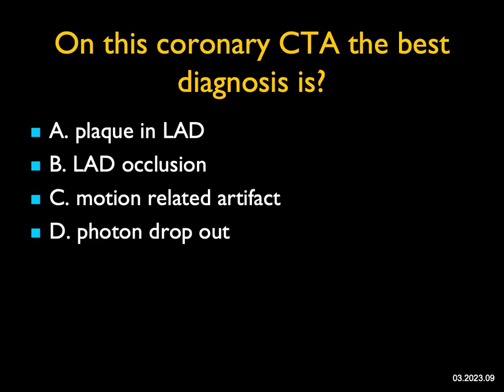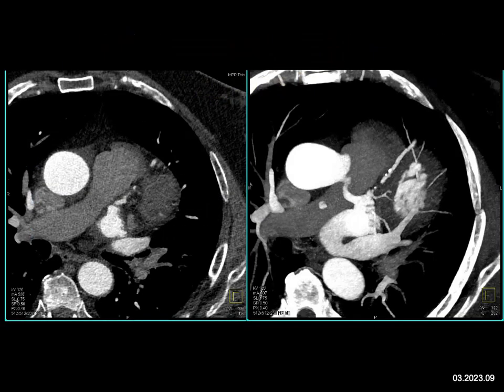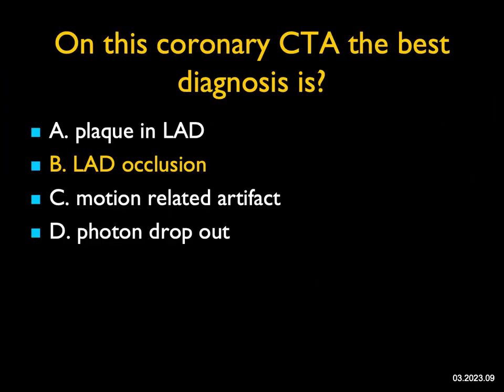On this coronary CTA, the best diagnosis — you're looking at the patient's LAD, which has calcified and non-calcified plaque, and especially in the proximal aspect of the vessel it looks like significant disease. There's no motion-related artifact and no photon drop-off. The LAD appears occluded, which is more than simply saying LAD plaque. That is indeed the right answer. This patient was eventually stented.